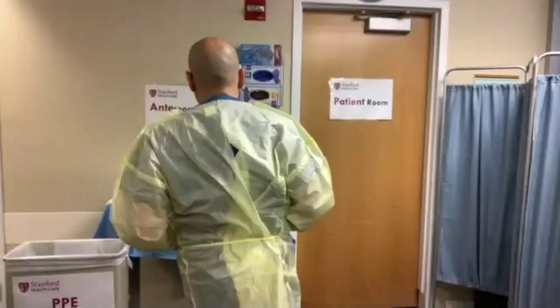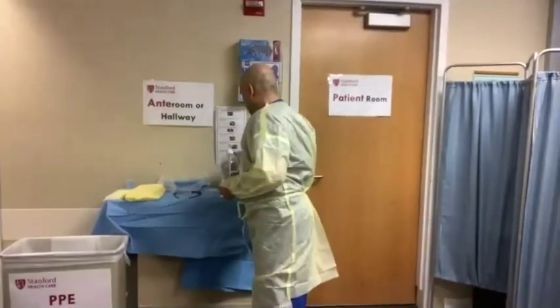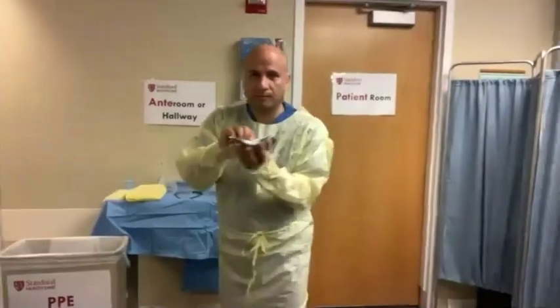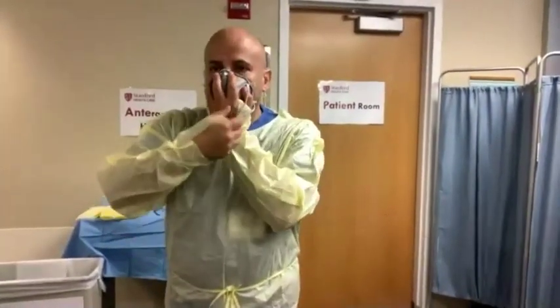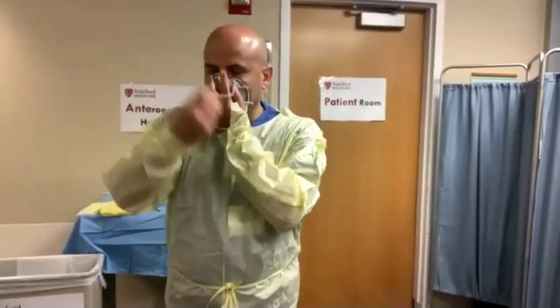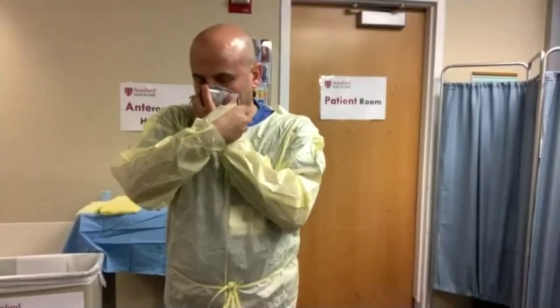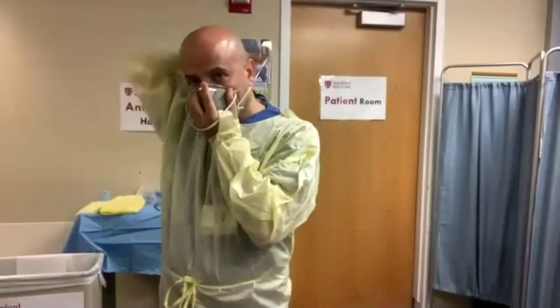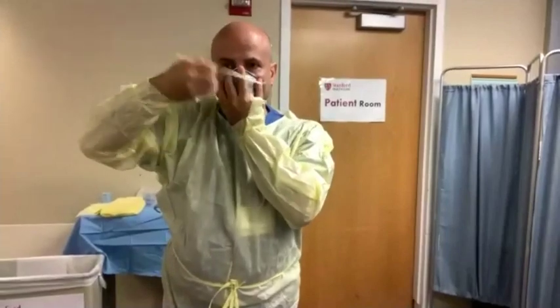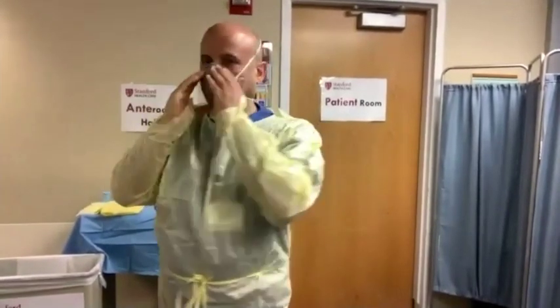The next step is to don the N95 mask. Pick up your mask and cup it in your hand. Lift your chin and place the mask over your nose and mouth. Stretch the bottom strap first over your head and place it on the back of your neck. Then place the top strap on the crown of your head, ensuring that the straps are not overlapping or crossed.